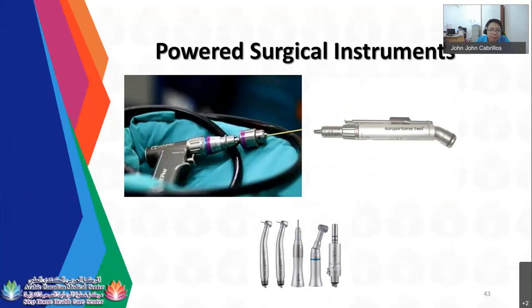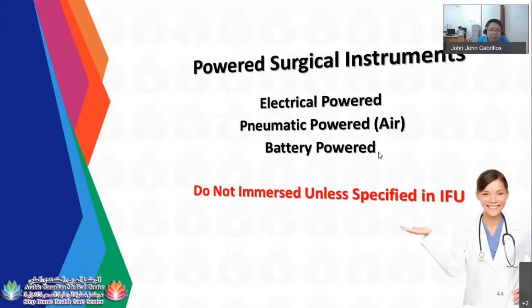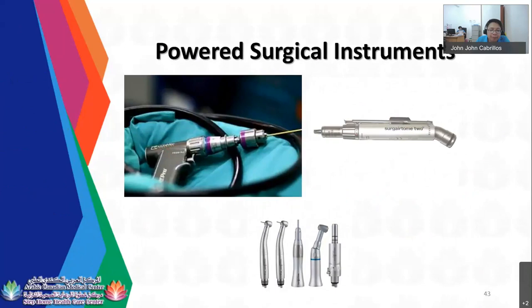So this is your sample of your powered surgical instruments. Powered surgical instruments are either pneumatic, powered by air, or powered by electricity. So it's either battery operated, pneumatic powered, or electrical powered. So you are advised to not immerse unless specified in your IFU. So if your instruction for use manual says that it can be immersed, then you can immerse it. But if you cannot read anything regarding soaking of the powered surgical instruments, then you are not allowed to immerse your powered surgical instruments. Actually, this is your sample of your powered surgical instruments.